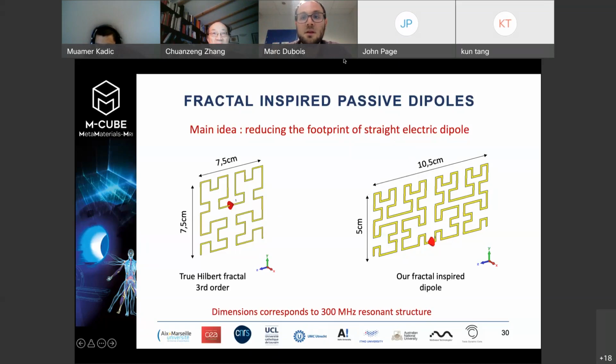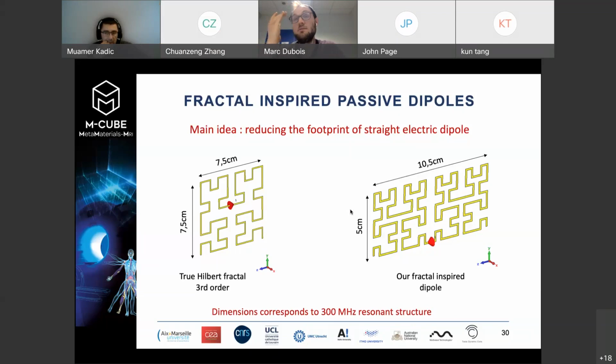Any thoughts about low field, smaller than 1 Tesla applicability? That's a very good question. So it will be different challenges, clearly. I think right now, in the last big radiology conference, Siemens put up like a 0.5 Tesla magnet. So they want to play both ends.